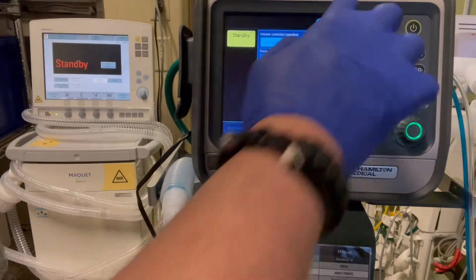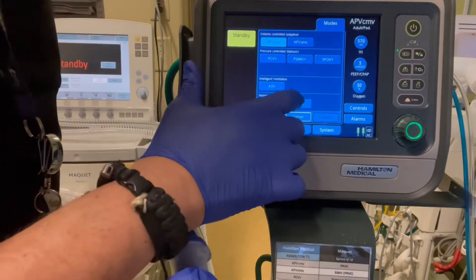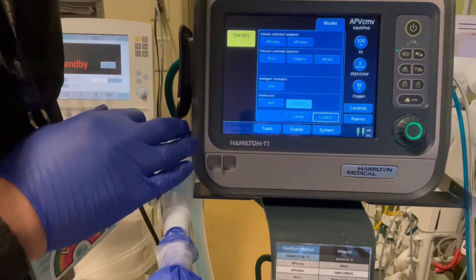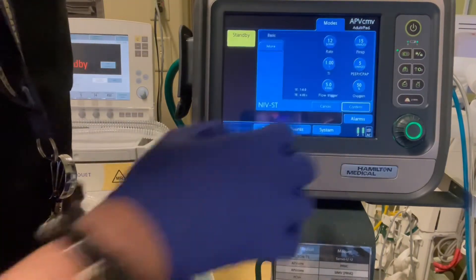Let's go to modes and we're going to look for non-invasive. We're going to go to NIV ST. We're going to hit that and that's going to give us ability to set an IPAP and an EPAP using V60 terminology and give us a backup rate. So we're going to confirm that.